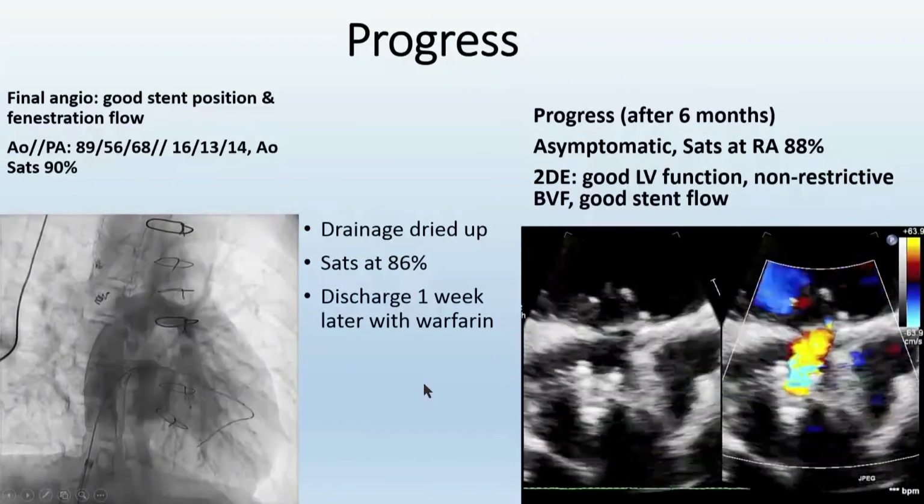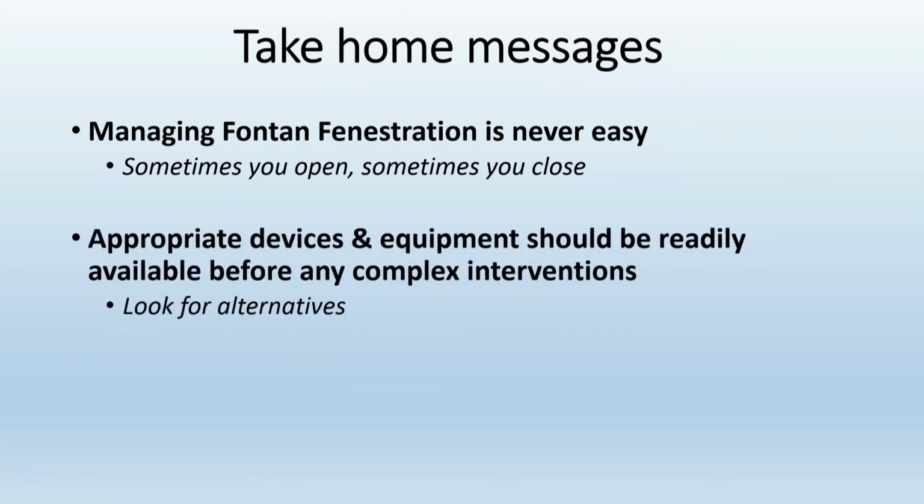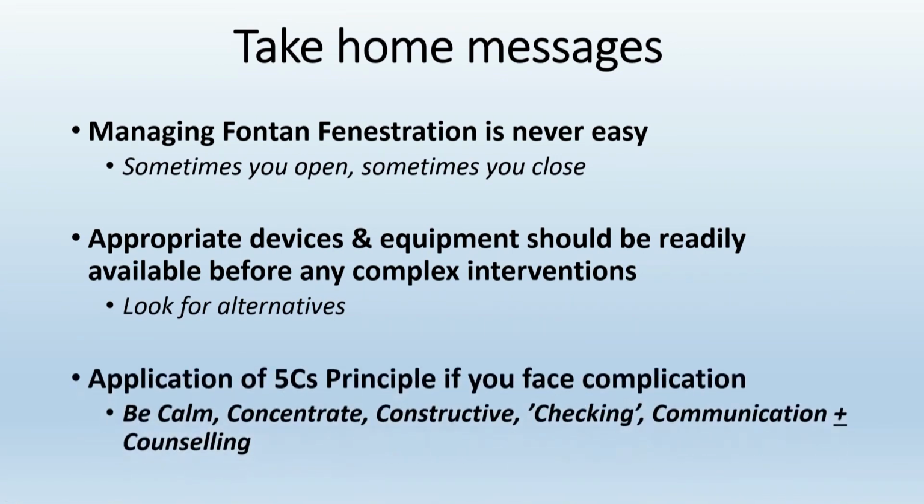So what are the take-home messages for this patient? Managing Fontan fenestration is never easy. Sometimes you may need to open, and sometimes you may need to close. And you have to make sure there will be appropriate devices and equipment available before any complex intervention, and you have to look for alternatives before you proceed with any kind of complex intervention. And remember the application of the 5Cs principle if you face a complication: be calm, concentrate, constructive, and checking, confirming, and also communication and counseling. Thank you very much.